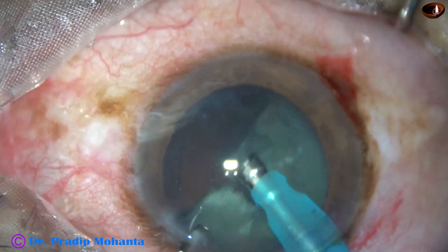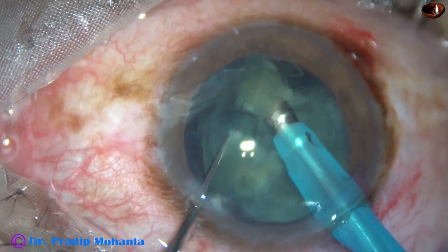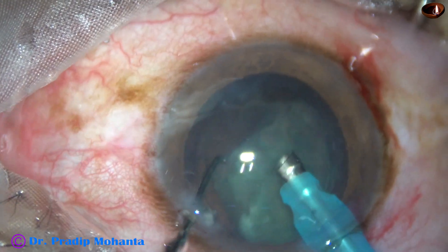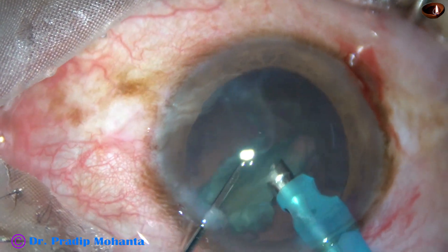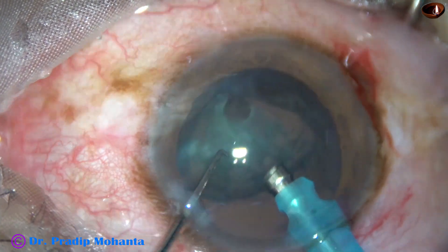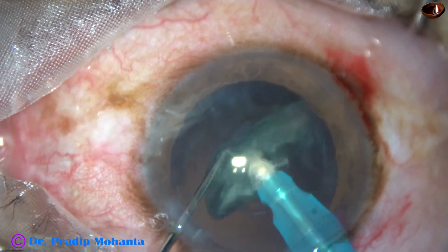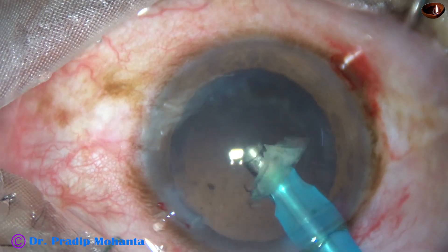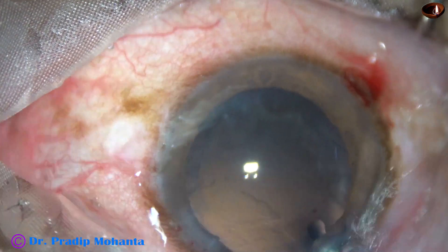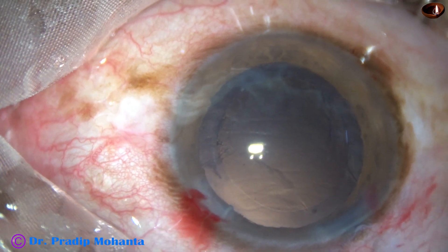Each nuclear fragment is emulsified with ultrasonic energy, which is 60% in this case. Flow rate is 45 ml per minute and vacuum is 450 mmHg. Each nuclear fragment is subdivided if necessary. This is the last nuclear fragment — it is emulsified, and at 3 minutes 32 seconds the nucleus is fully managed.